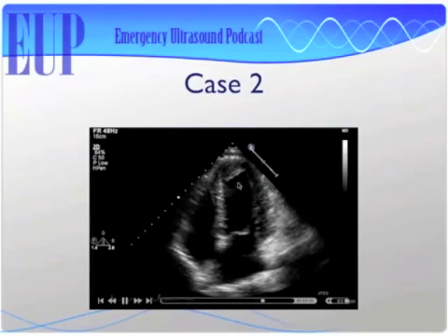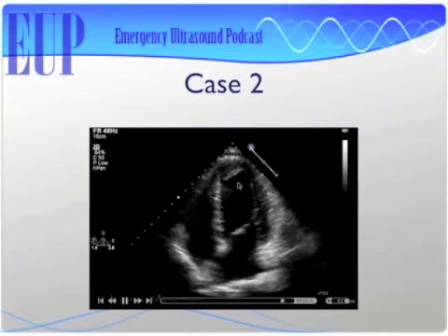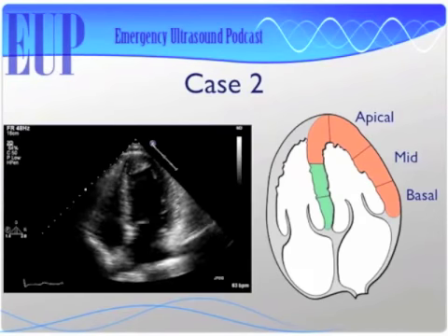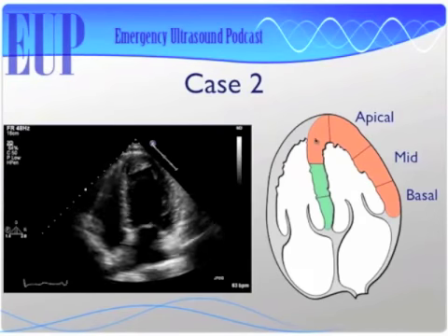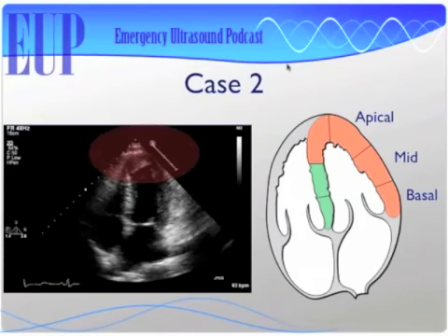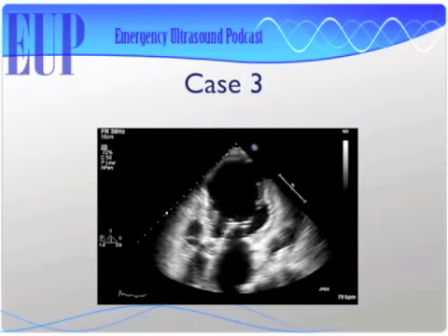Did you see that? I think I just saw a little part shoot off into the... just shot right off into the carotid. Yeah, they just stroked right there on that echo. Wow, it's terrible. All right, so interesting finding, not necessarily something you want to see in one of your patients. And here we're just showing the apex all the way to the top here, which is typically LAD distribution. Voila.